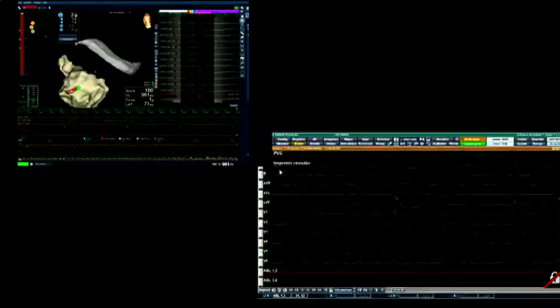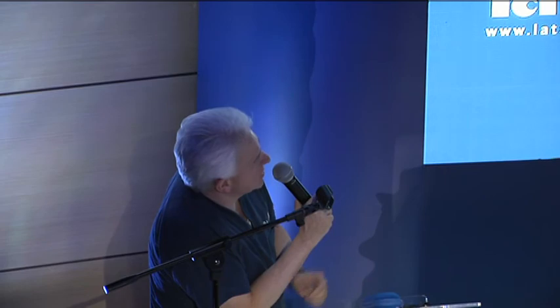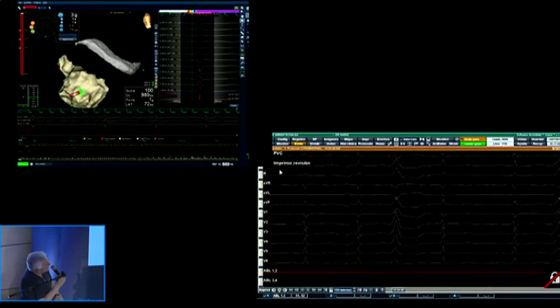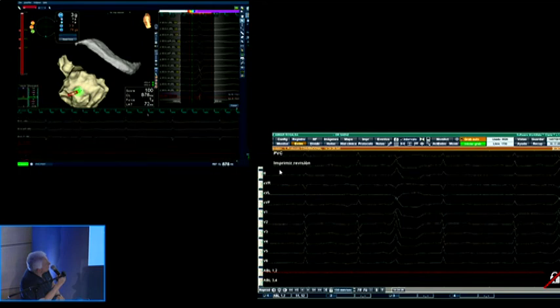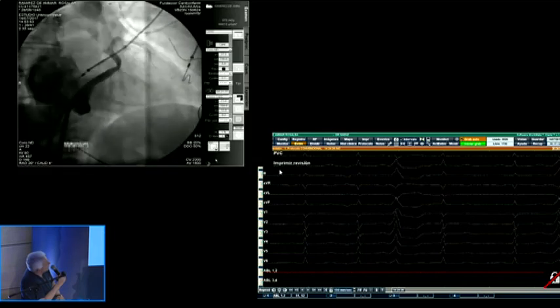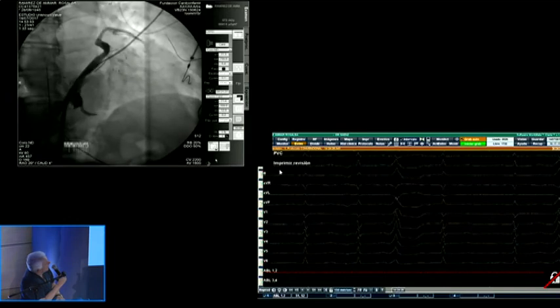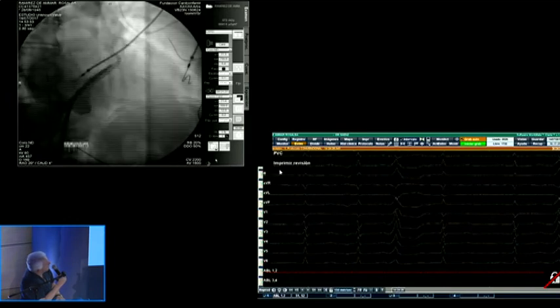Can you zoom, Fermin? Yes. Can you tell, you use the microcatheter in the CS? Do you do this in every case? I want to show. Pónganos la fluoroscopia, por favor. Show the fluoro. Yeah, what I want to do, Andrea, is to show first what I... Español. I'm going to speak in Spanish, Andrea.